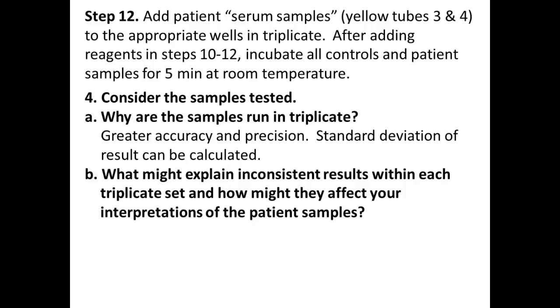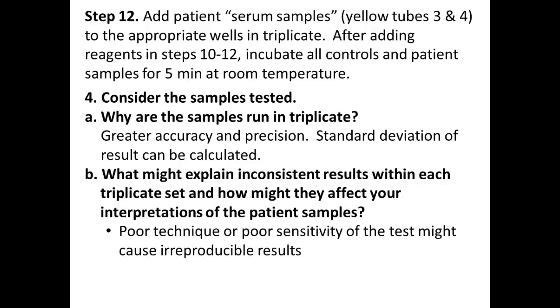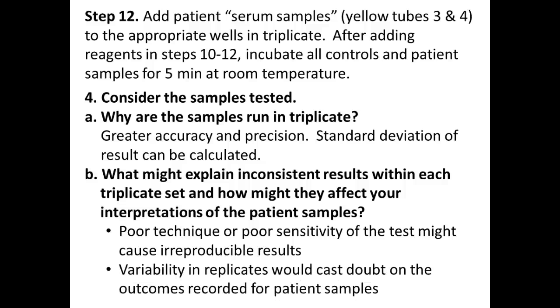Why would you get inconsistent results? Well, you guys are new at this, right? So it could be poor technique, or poor sensitivity of the test. How good is it at detecting what's present? And of course, if you have extreme variability, this would cast doubt on your results for your patient samples.